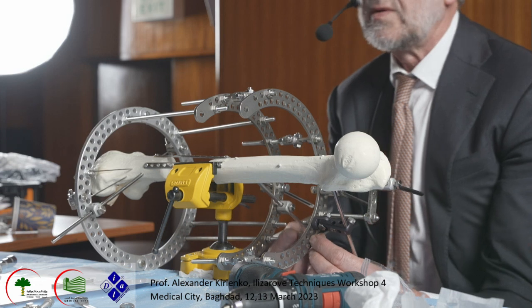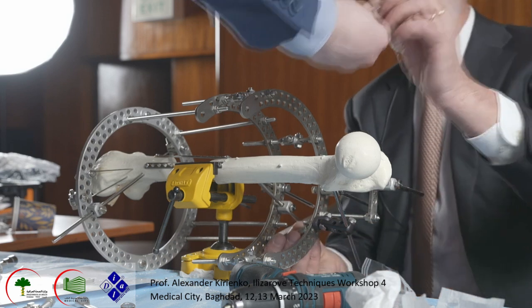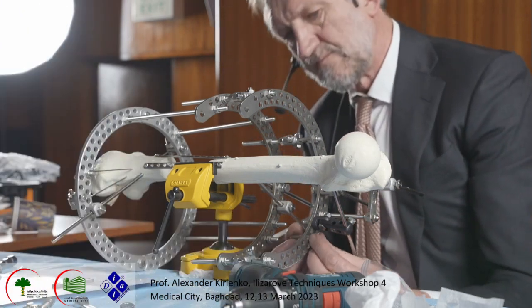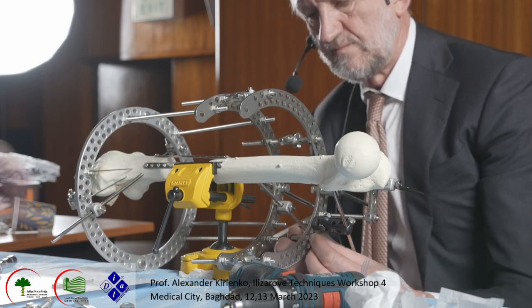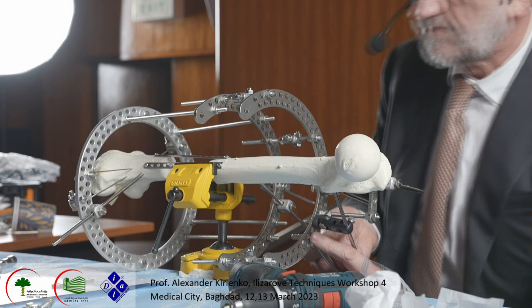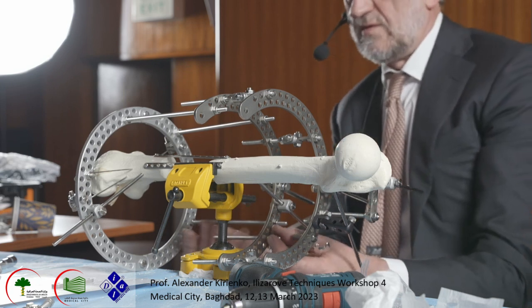A small bolt, please. Small. Okay. This rod is not good here.